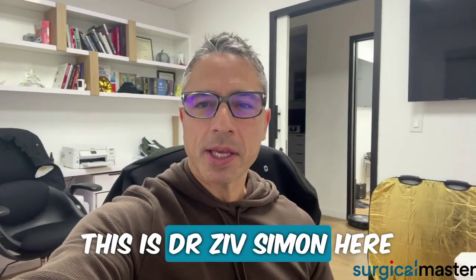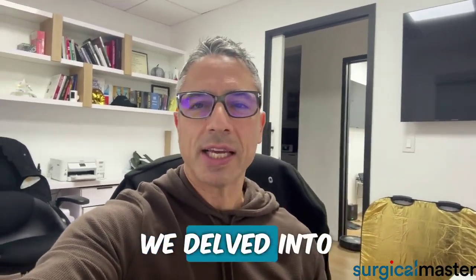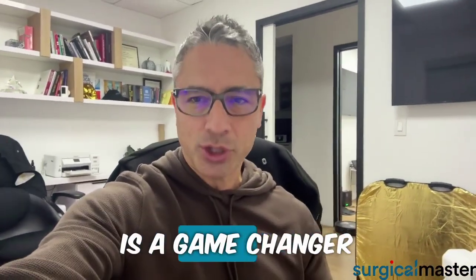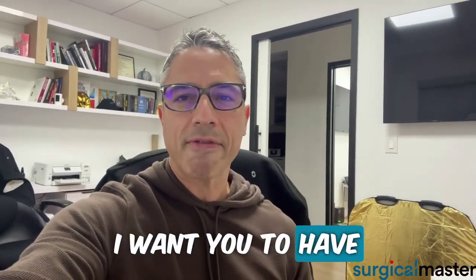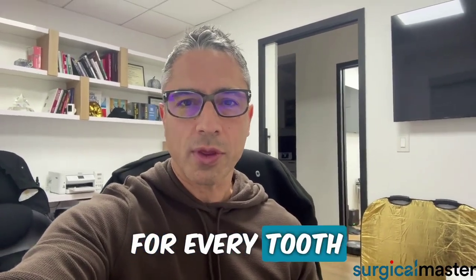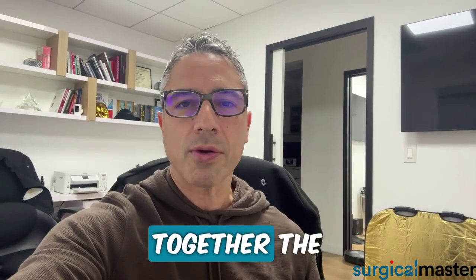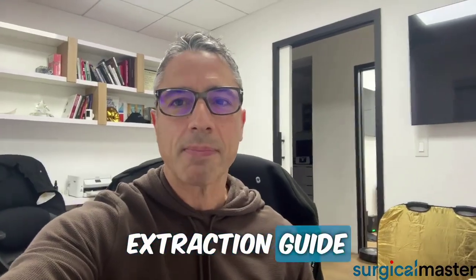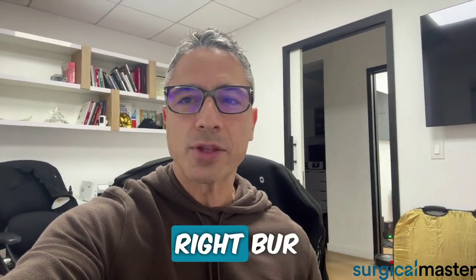Hey everybody, this is Dr. Zeev Simon here. If you caught my last email and video, we delved into the world of forceps and why understanding tip design is a game changer. My goal for you is simple: I want you to have an extraction plan for every tooth, like a well-crafted recipe. Today, I want to share a bit about splitting teeth and the secrets of using the right burr.